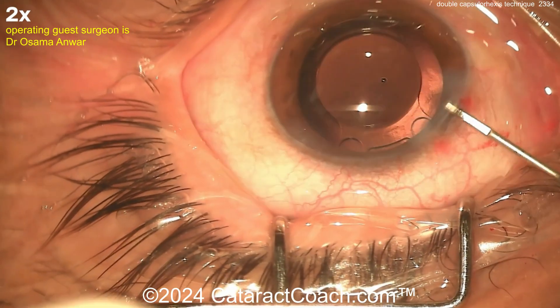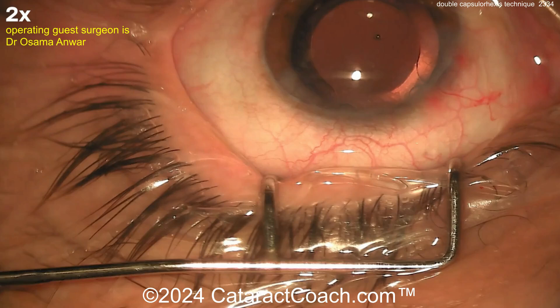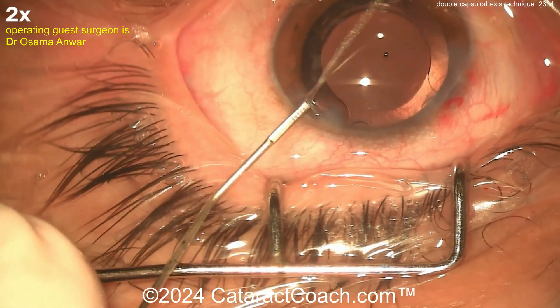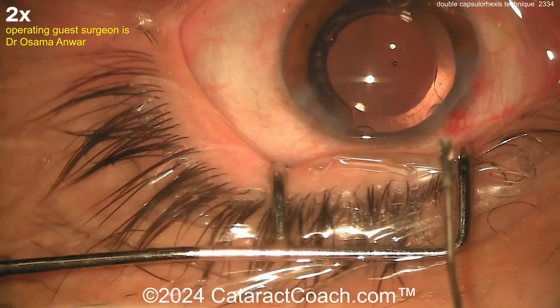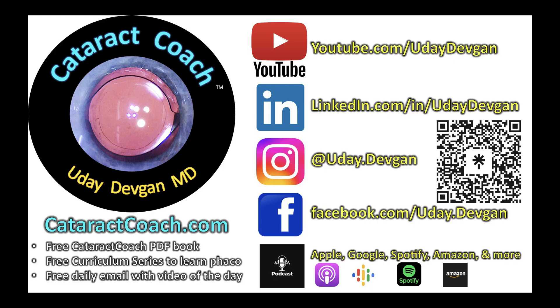At the end here, sealing up these incisions — this looks great. The patient is going to be so absolutely thrilled. Try the double rhexis technique when you have one of these cases. There are other methods as well, and we've talked about all those on CataractCoach. If you go to the CataractCoach website, there's an entire section about white cataracts where you can learn all the various techniques. Check it out — it's a lot better than just searching on YouTube. CataractCoach.com, your favorite website.